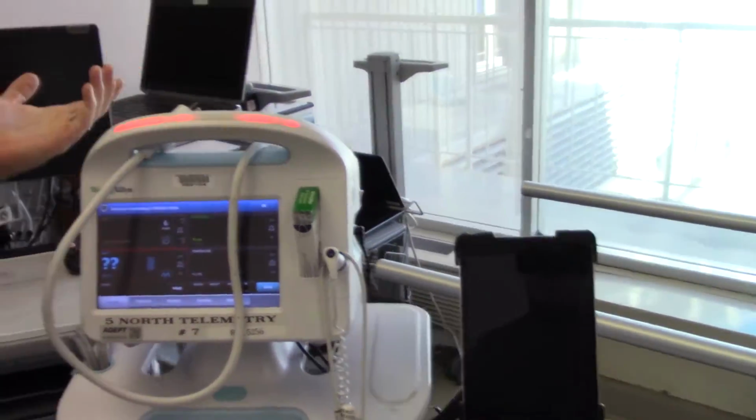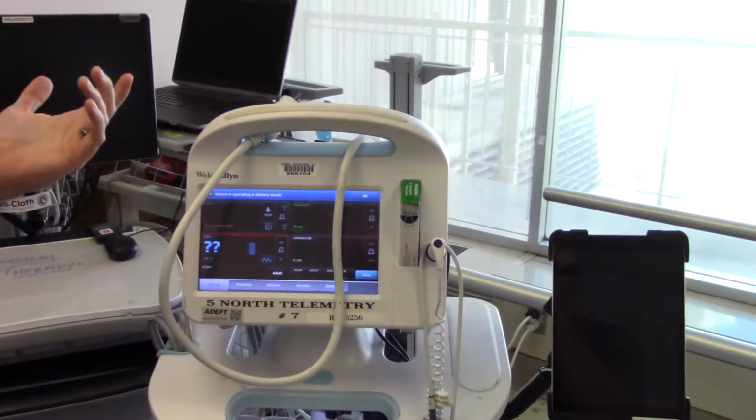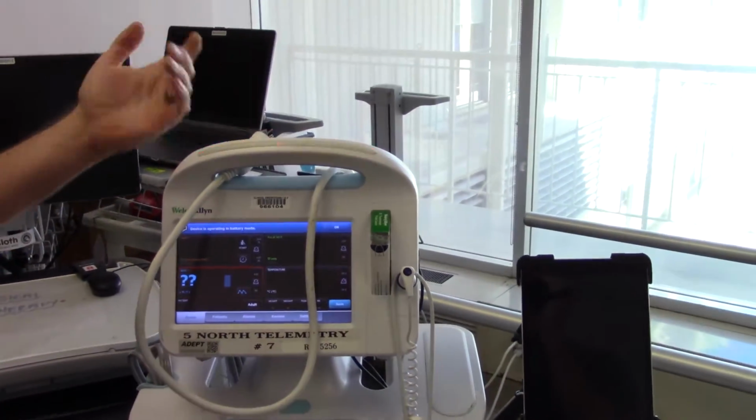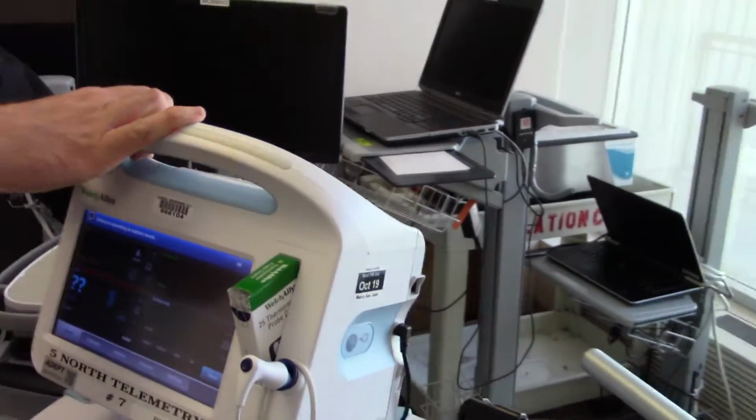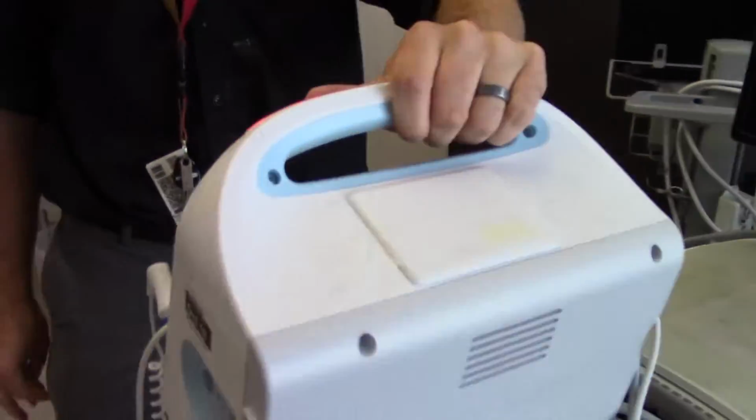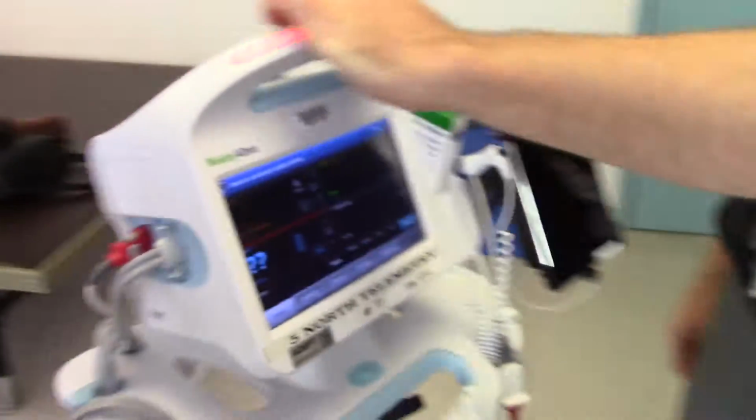So this is the Welch Allyn. I mean, what is that, 6800 Welch Allyn? I can't remember the series or the model name of it, but yeah. So the Welch Allyn vital device. Let me move it around this way, because I'm getting backlit over here. There you go. Much better.